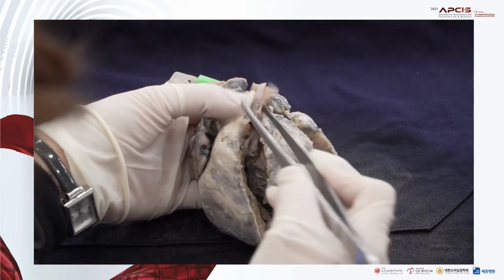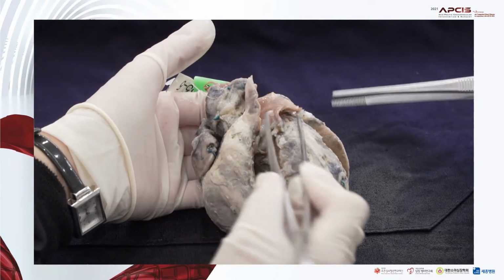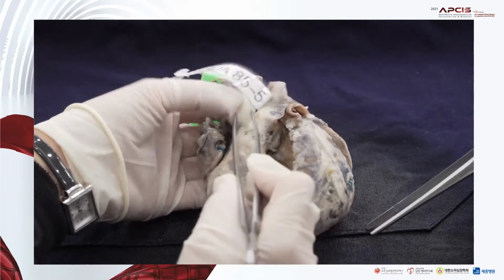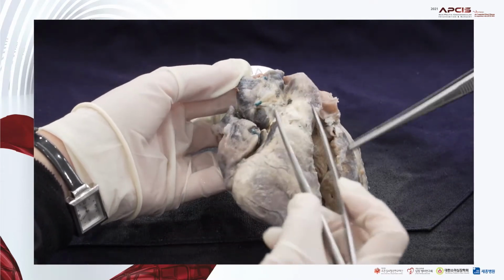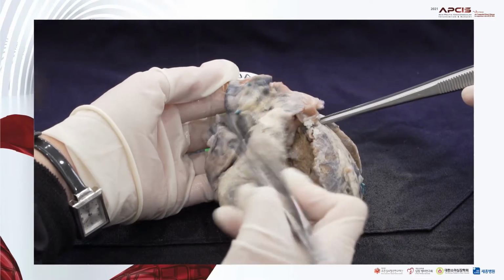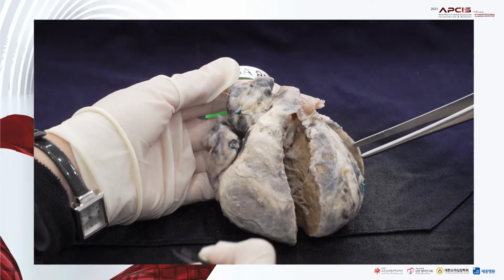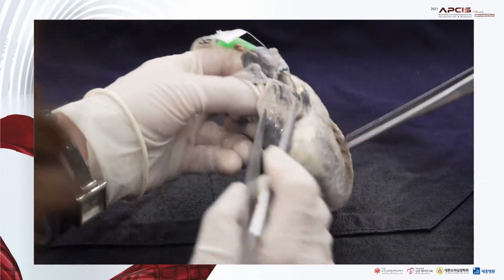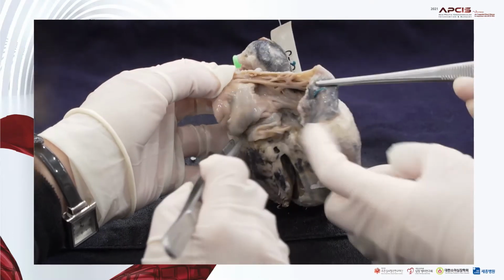In this case, we can see a relatively sizable pulmonary trunk here, but the ascending aorta is rather big, and also is deviated to the right compared to the normal position. And this is the right atrium.